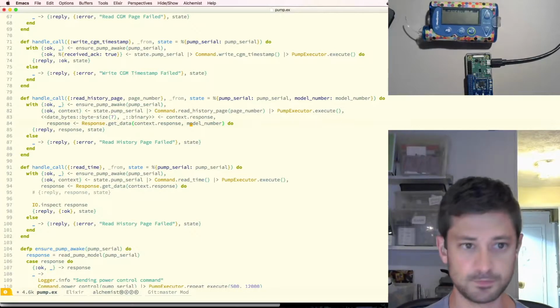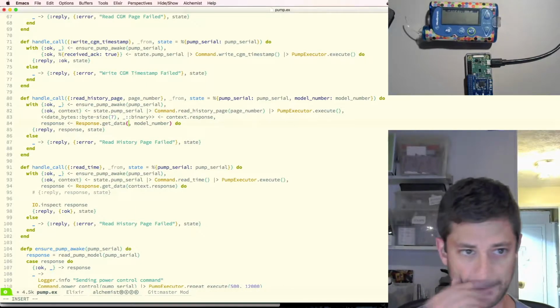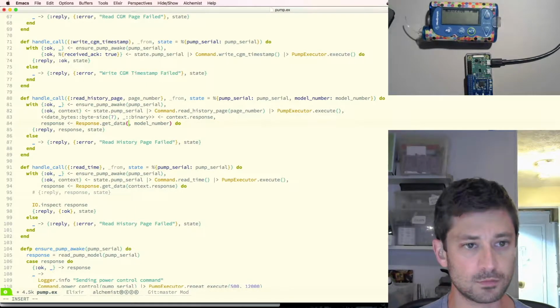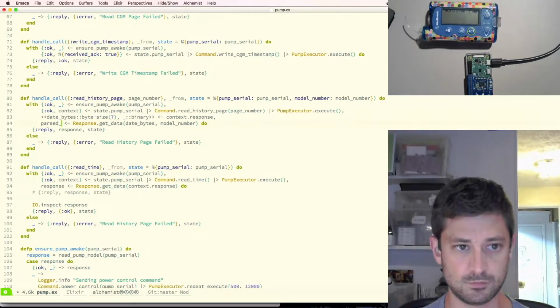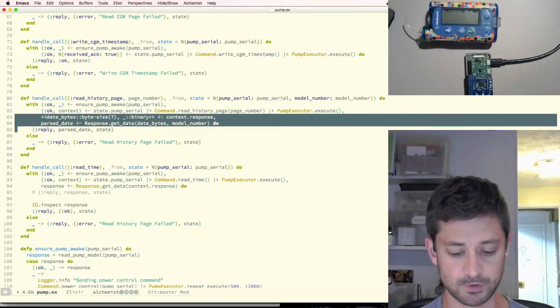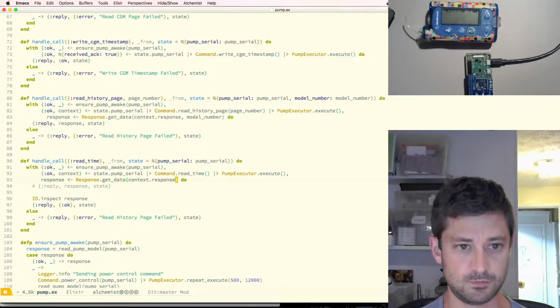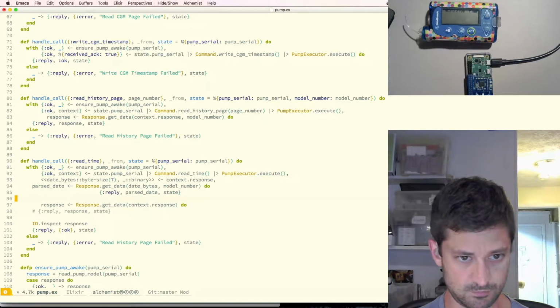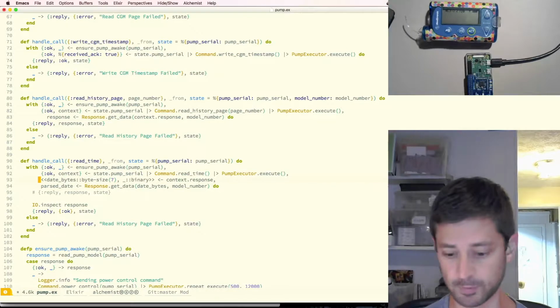Find out soon enough, I guess. And I've been modifying the wrong function. That's a little bit better.